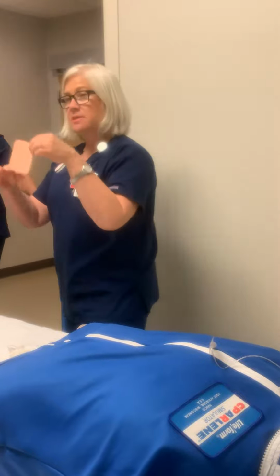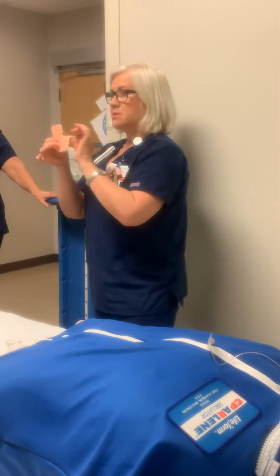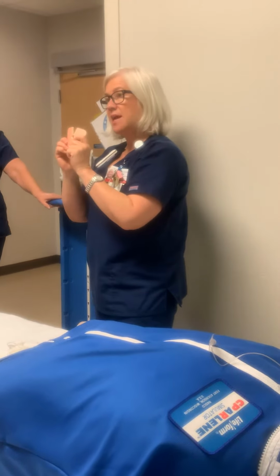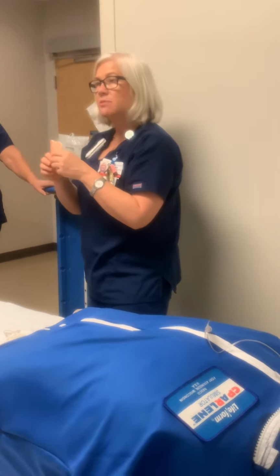The nice thing about these is you can cut these, you won't get shards like you do with these 4x4s here. So if you cut them, you get those and they can get in the trachs. Yeah, so you can cut them, you can manipulate them. They can stay on for 7 days, mildly absorptive, and they fit beautifully, and they also prevent the breakdown that we see with trachs.